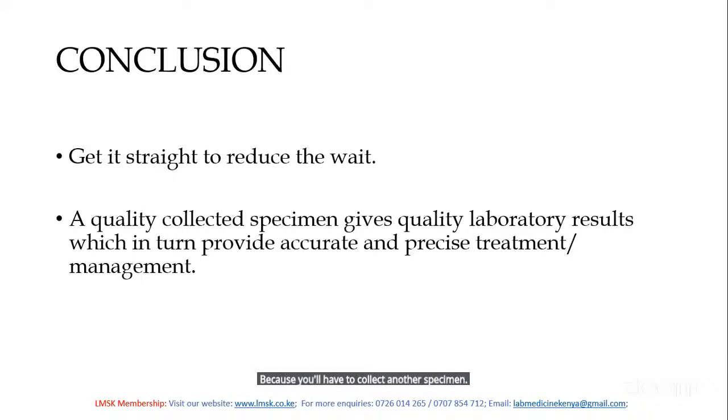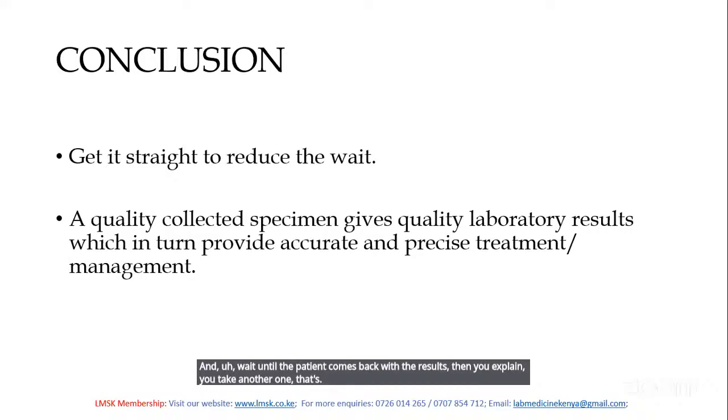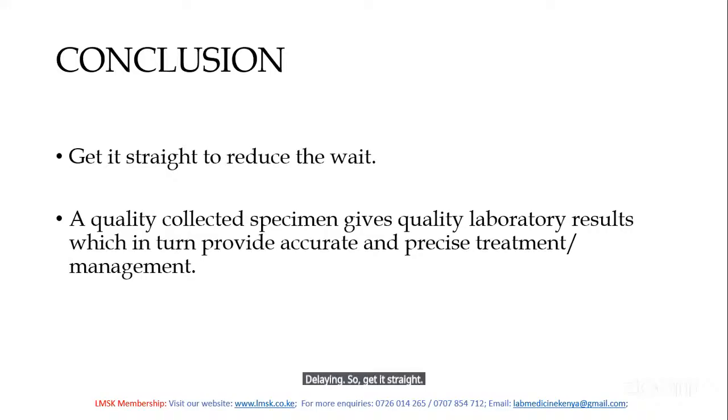That tortures the patient. You place the specimen aside and wait until the patient comes, then you explain and take another one. That's delaying. So get it right to reduce the waiting time.